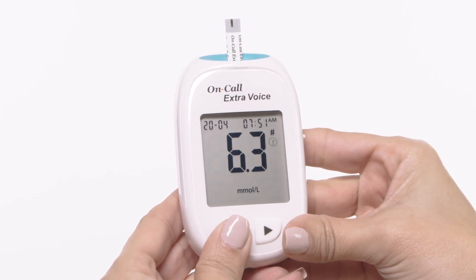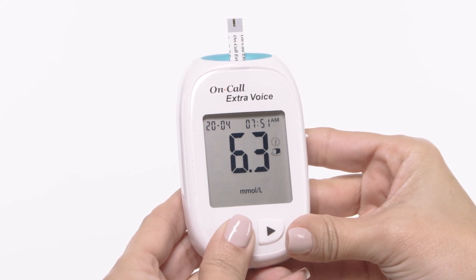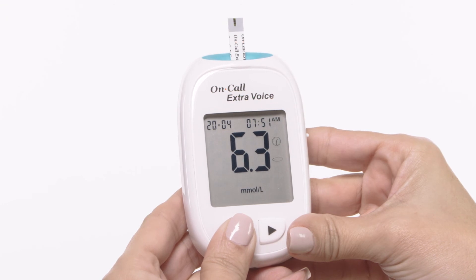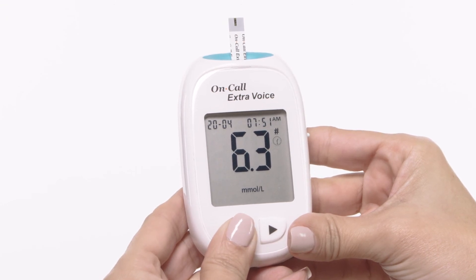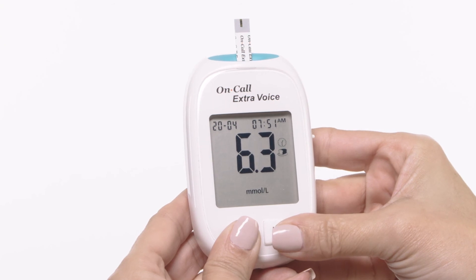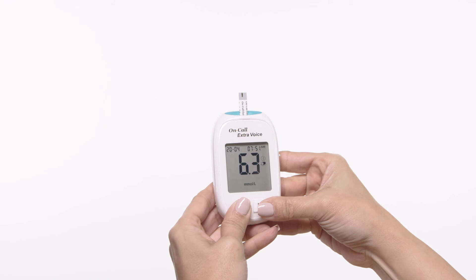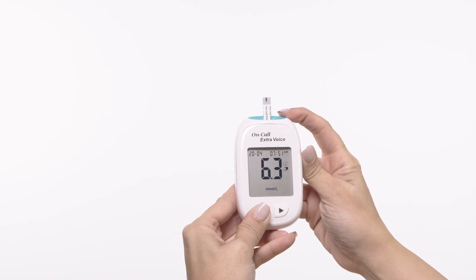After deciding the selection, press the right button to confirm the selection for either before meal marker, after meal marker, invalid result with the pound sign, or none of these three symbols. If an invalid result is marked, run the test again with a new test strip. Slide forward the strip ejector to discard the used test strip.